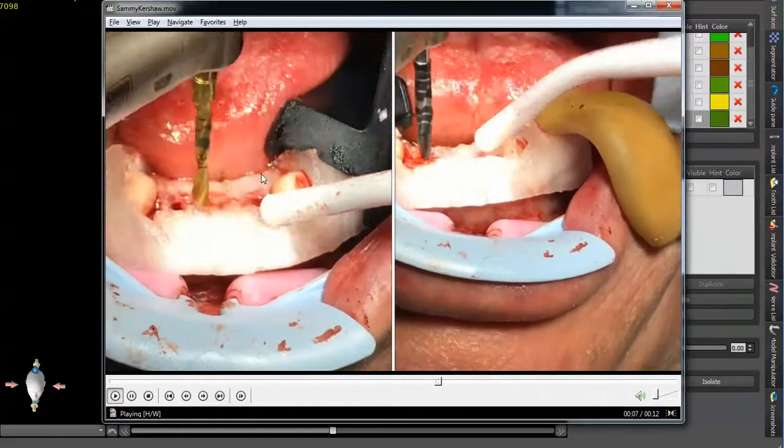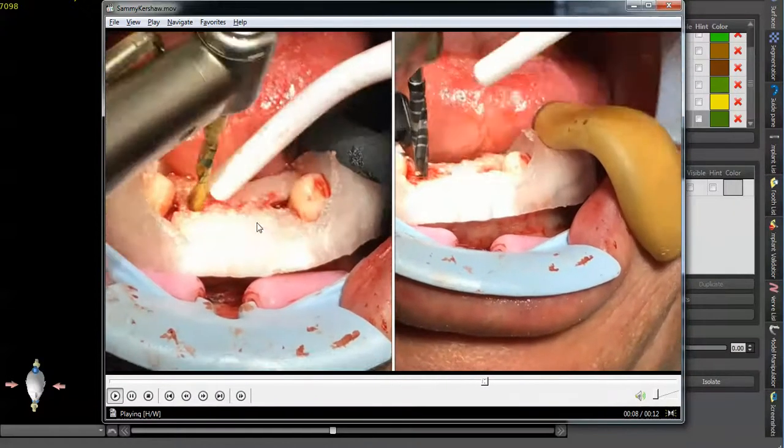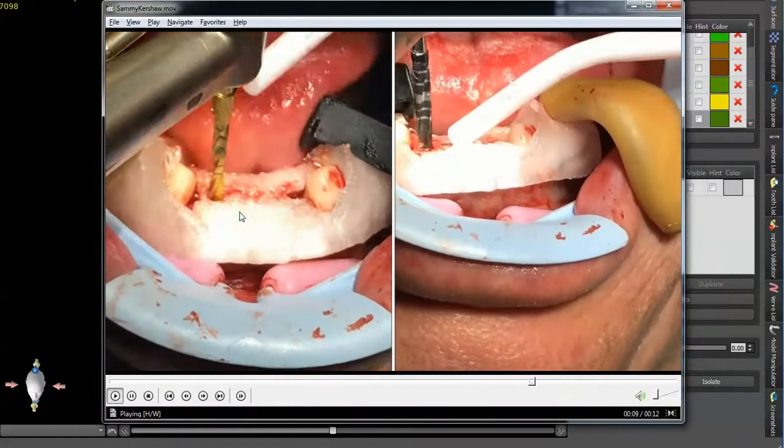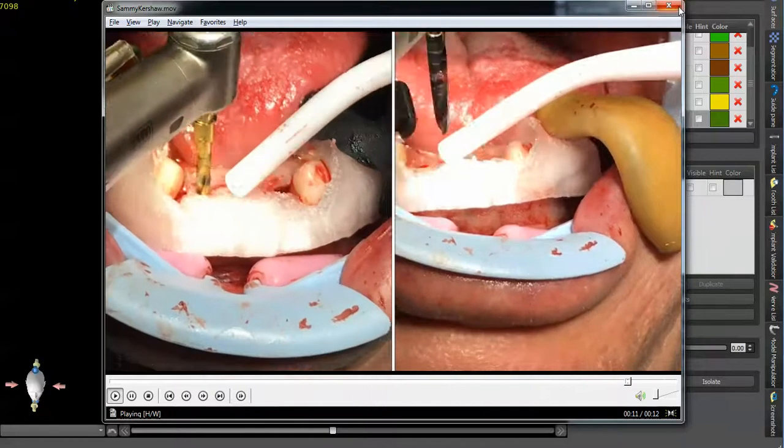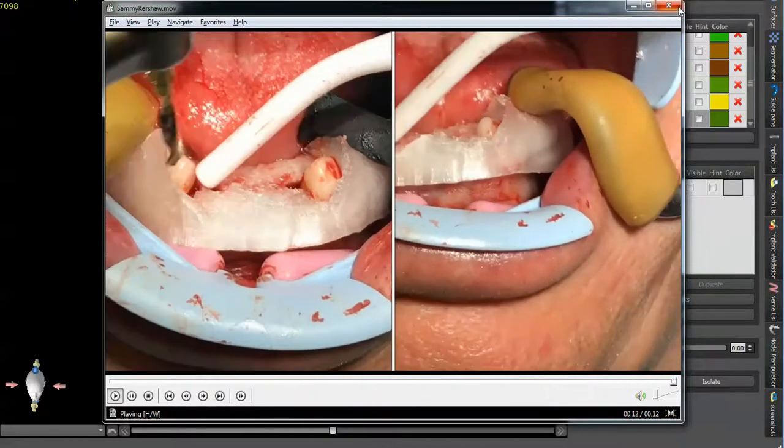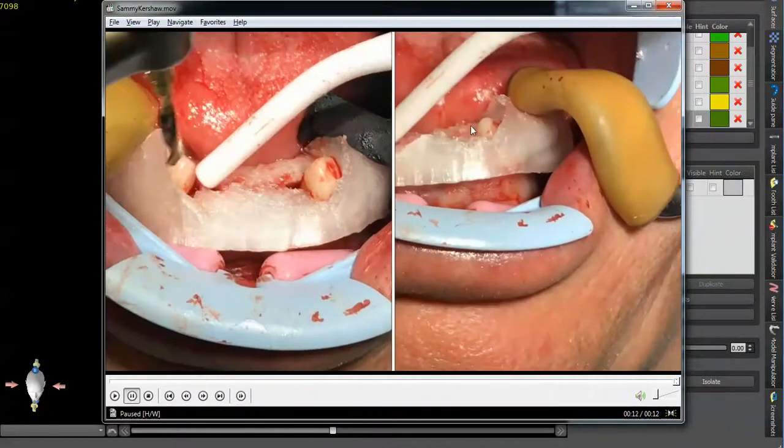Essentially this is just getting me a landmark for my initial drill. But you can see my drill curves off a little bit once it hits the floor where the tooth was previously extracted.